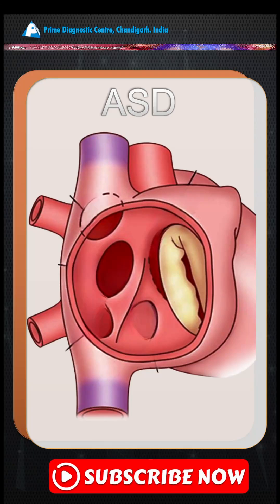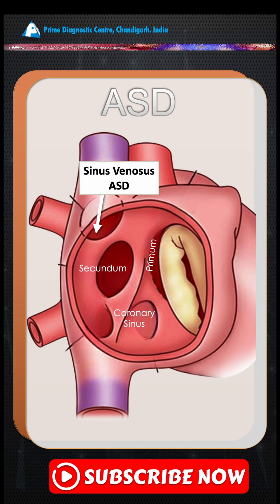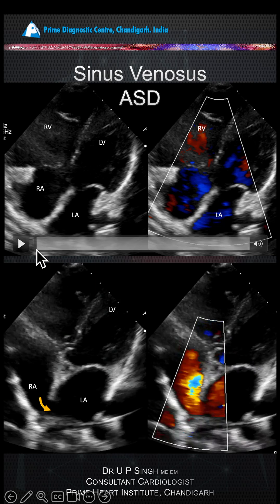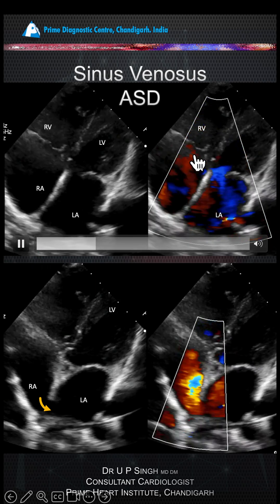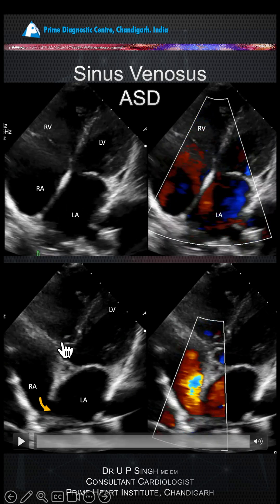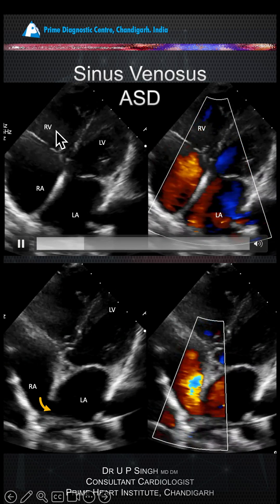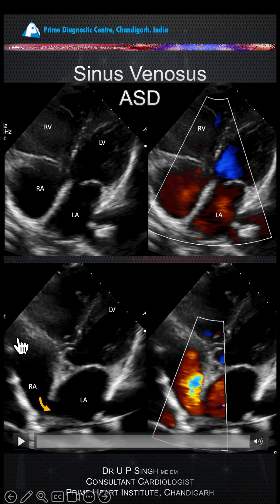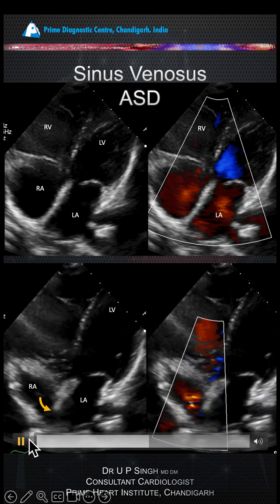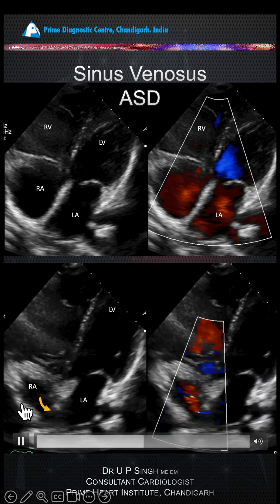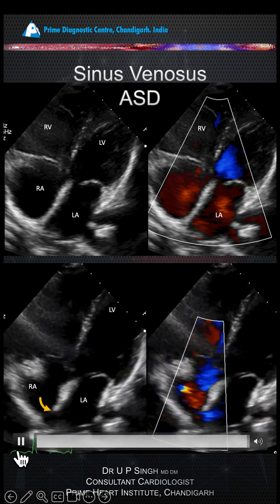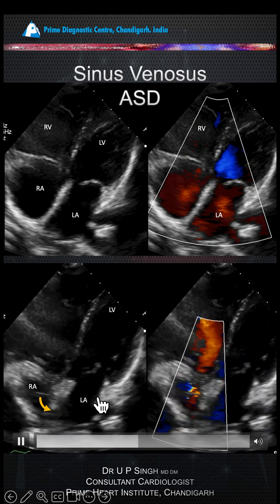We are talking about atrial septal defect, specifically the sinus venosus ASD, which is relatively uncommon. If you see on a color Doppler four-chamber view more flow in the right ventricle than in the left ventricle, it arouses suspicion — with a dilated RA and RV — that there is increased left-to-right shunt. Moving the probe cranially, you can see a small defect which is not very easy to visualize. This is a sinus venosus ASD.